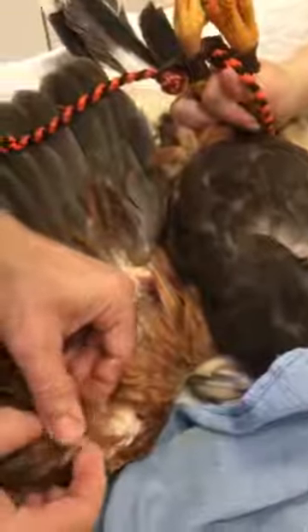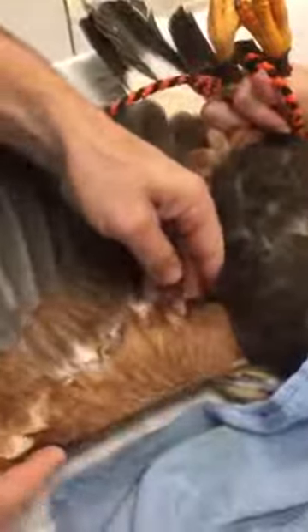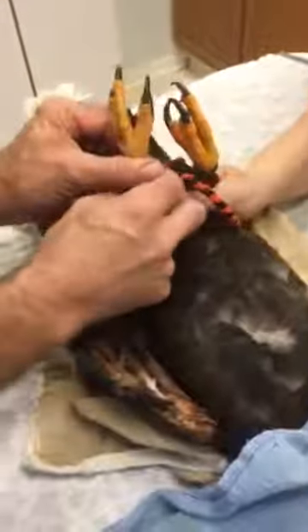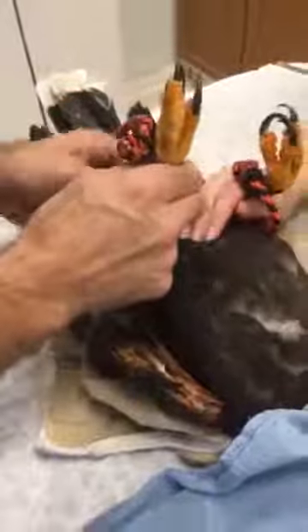Healthy tissue. Matthias is going to expose a vein so that he can take some blood. We get baseline blood numbers on our birds on intake so that if they ever do get sick, we can take their blood and compare it — things like white blood count. We'll get the blood once she is under anesthesia in a minute, as it's safer for everybody.